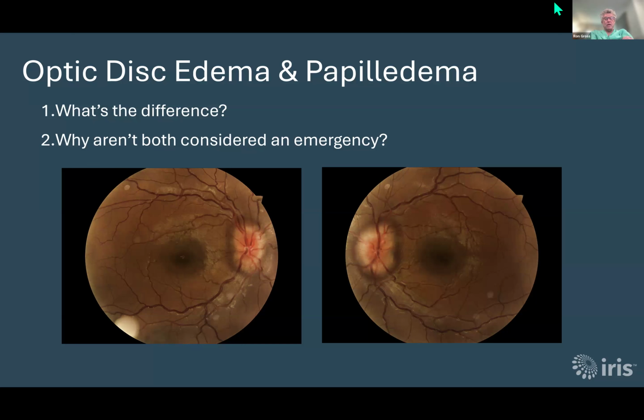designate as an emergency. If we see it immediately, we have a cascade that's in place so that literally as soon as you possibly can get it, we'll get the information to you so that you can contact the patient. And in most cases, the patient ought to go to the emergency room because, again, from just the picture, we can't tell what their risk is, but there is some risk that this could be life-threatening in a very short period of time. And if that's the case, we sure want to do everything we can to avoid that. So we've set up that cascade.